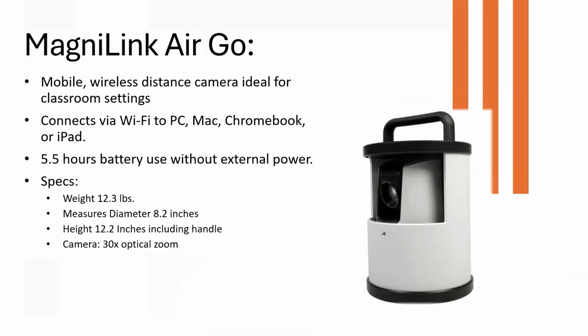The last product that we're going to feature today that also works with our iPad is the MagniLink Air Go. This is one of our newer products. If you haven't seen it, by the way, we will be at ATIA and we hope you come by our booth, and we will have this product there. It will connect to your iPad. It does have a battery in it that lasts 5.5 hours, so it gets you through a school day. You can use it with or without having it plugged in. But if you have a fully charged battery, again, you're going to get about 5.5 hours of use.